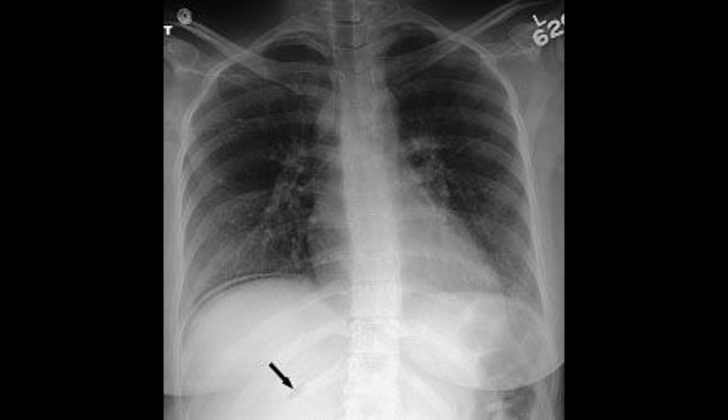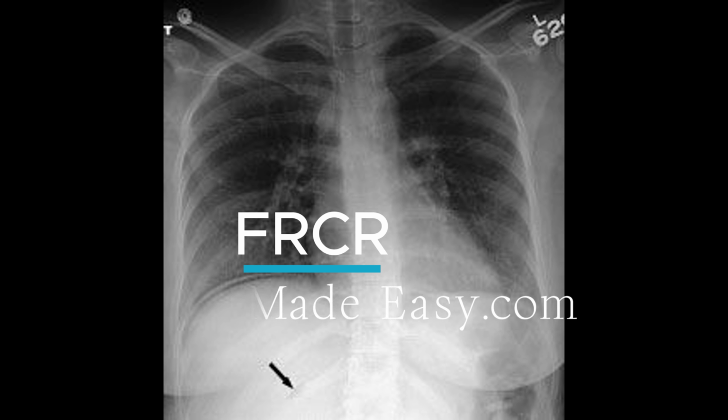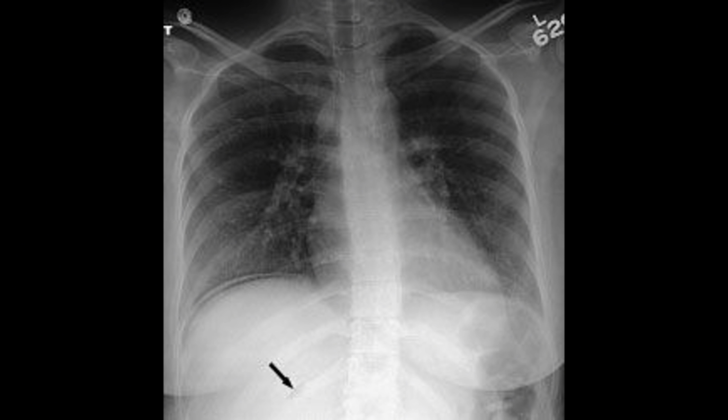When encountered in the reading room, it is essential to review the clinical history to determine whether the patient has had recent surgery or procedures, as postoperative free gas is common and usually resolves within 7 to 10 days. In a patient without recent surgery, pneumoperitoneum should be assumed to represent a visceral perforation until proven otherwise and is a surgical emergency. Increasingly, CT is used for confirmation and to locate the site of perforation, as it is far more sensitive than plain radiographs.